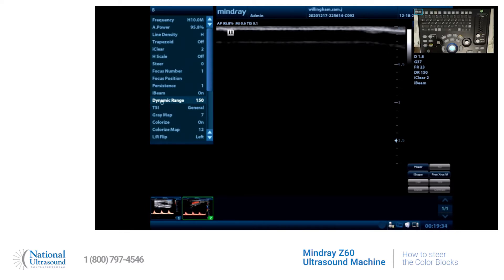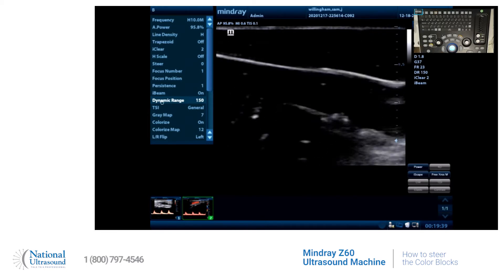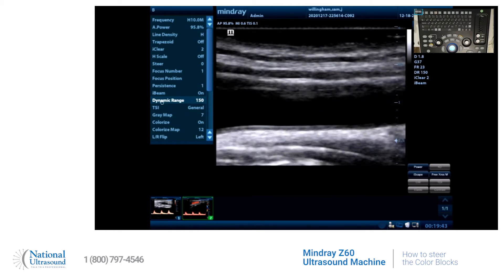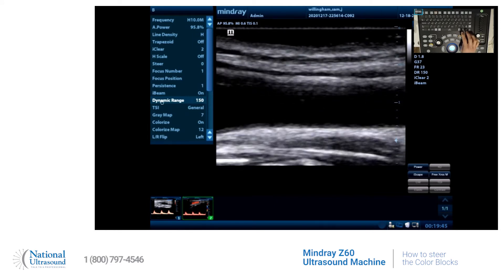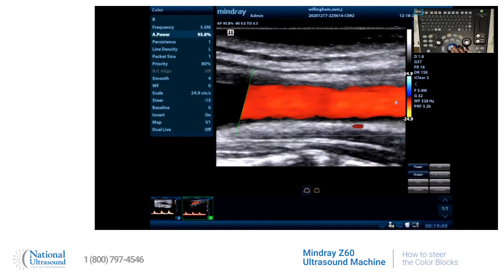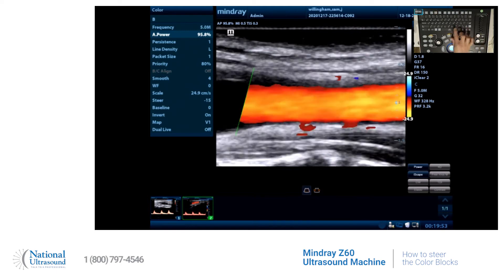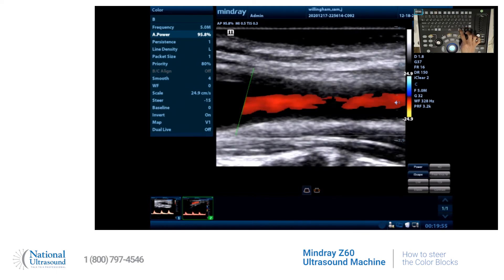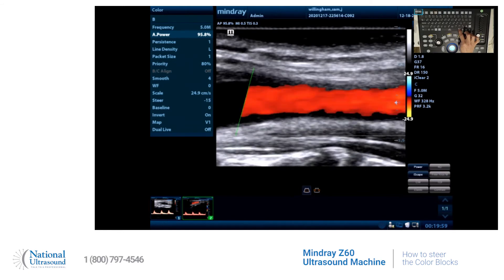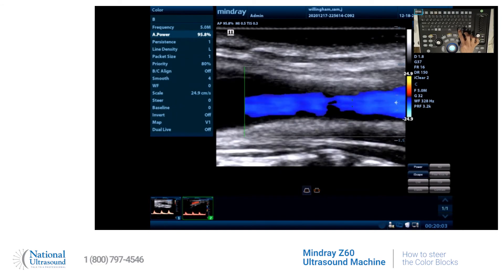First we're going to get our picture. Once we have our picture, the way you see your color box — if you look here on the screen, the button that says steer — you have three choices: negative 15, 15, and zero.